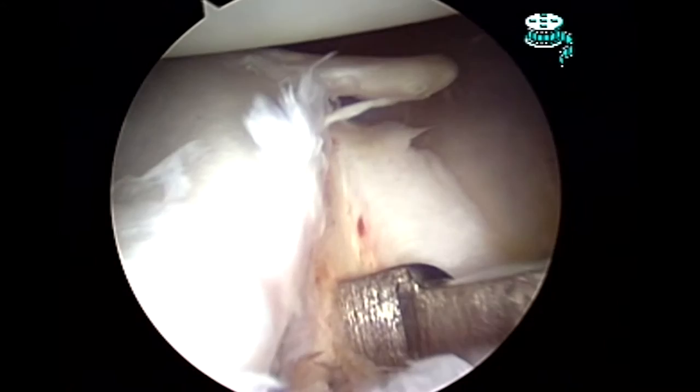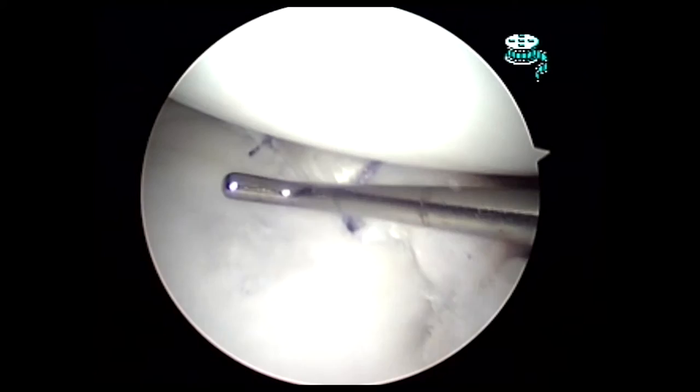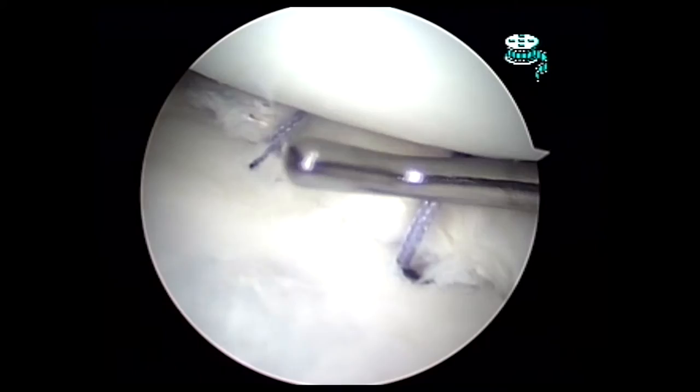The labrum can be repaired back to the socket using a combination of sutures and suture anchors, which hold the labrum back to the bone. In this case, you can see the labrum placed back onto the face of the socket, and the ligament complex is now under appropriate tension.